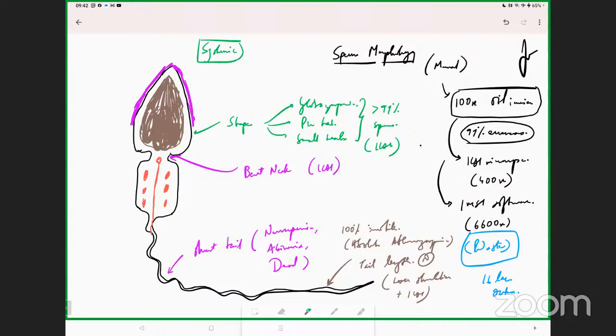Okay, all the other problems which happen, like a large vacuole which is present, all the things which happen inside the nucleus, vacuolated nucleus, large nucleus, round head, this, that, all these things, vacuolated is the most common thing which you find. This is all going to be due to external causes. How do you identify if it is a vacuolated cause? The only way to identify it is on an IMSI microscope. Otherwise you can't really identify it easily, and even if you identify, it will be wrong.